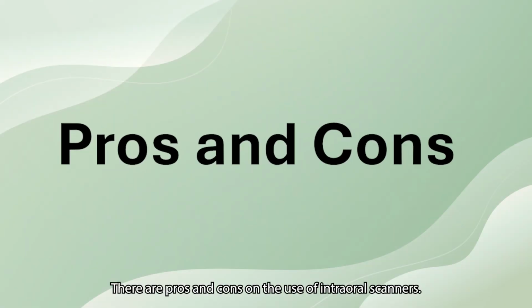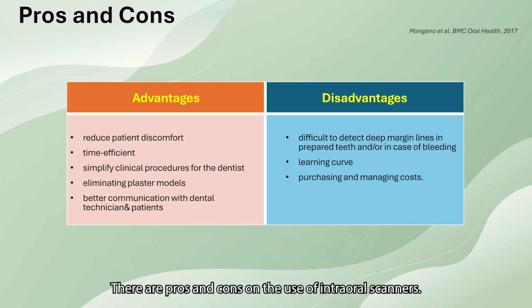In this MOOC, I'm going to talk about the clinical use of intraoral scanners. There are pros and cons on the use of intraoral scanners. The treatment time will be reduced. Patients will feel more comfortable. And we do not need to pour and store the stone casts.